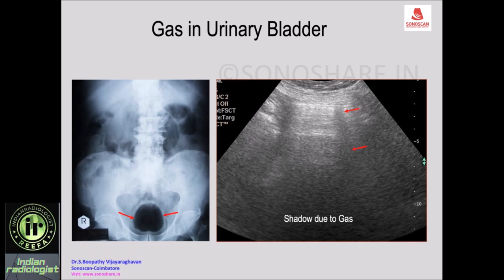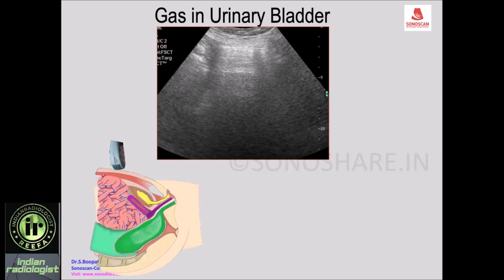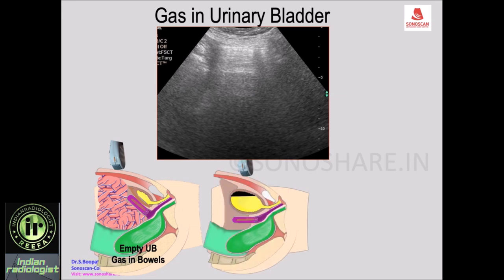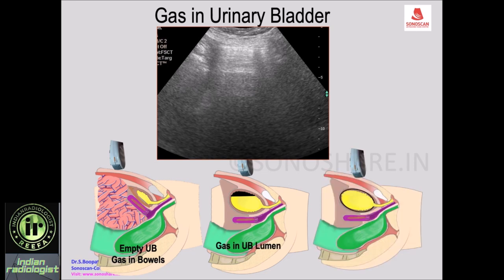We cannot differentiate this from an empty urinary bladder, with gas-filled bubbles taking the place of the urinary bladder giving the same appearance. When there is gas within the urinary bladder it also appears the same. The third condition with a similar appearance is gas within the wall of the urinary bladder, which we see in emphysematous cystitis. All three conditions produce the same picture with a dirty shadow.